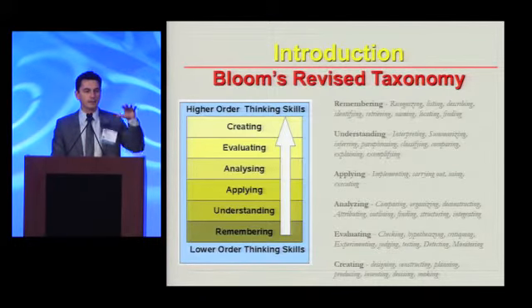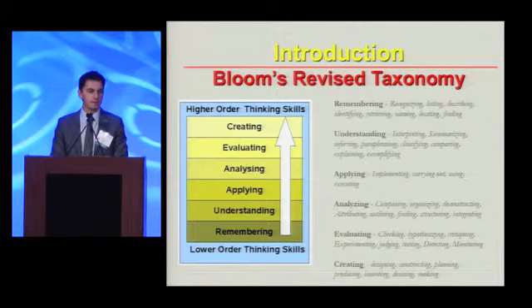Well, we like to think that we're analyzing, evaluating, and creating all the time, but in reality, it's very helpful to go back and recall and revisit our basic understanding of what we're doing and how we get there. And that's what this talk's going to be about.